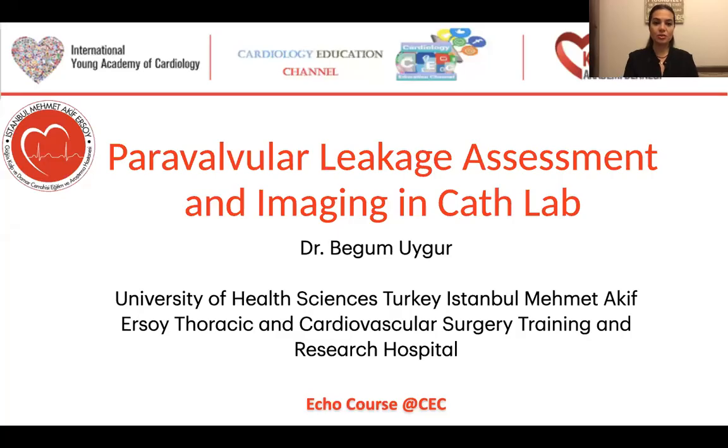Dear chairs and colleagues, today I'll try to talk about the assessment of paravalvular leakage and what we do as an imager in the Cath lab.